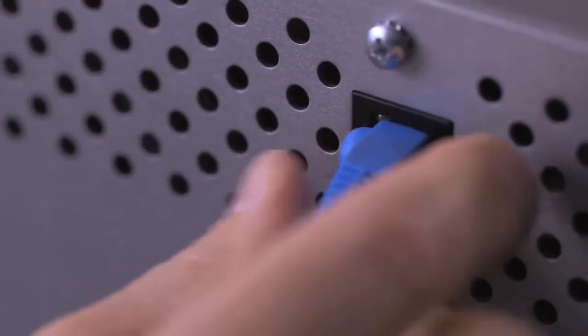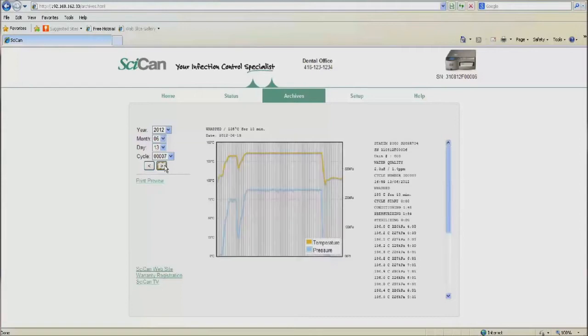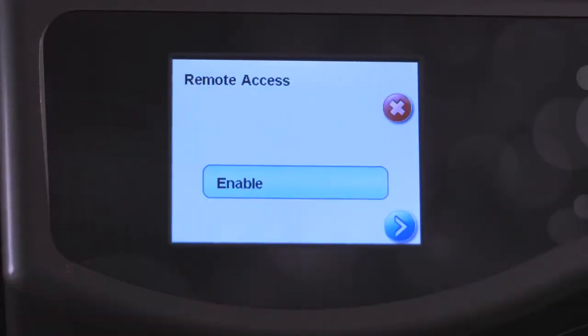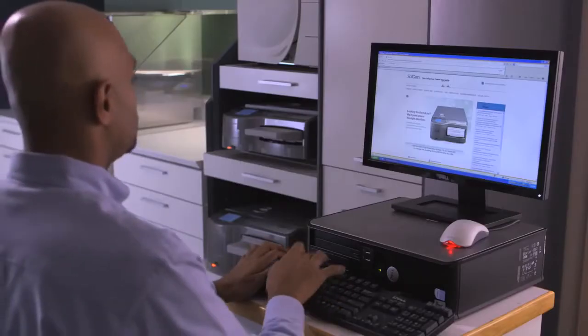Beginning with a new world of sterilizer options made possible via the G4's Ethernet connection. Staff can instantly view the status, print any cycle ever run, and store all records on the cloud for safekeeping. Should the G4 ever need attention, diagnostic information is sent via email to pre-selected dealer service reps, drastically reducing downtime. The dealer is given a security token by the office staff.